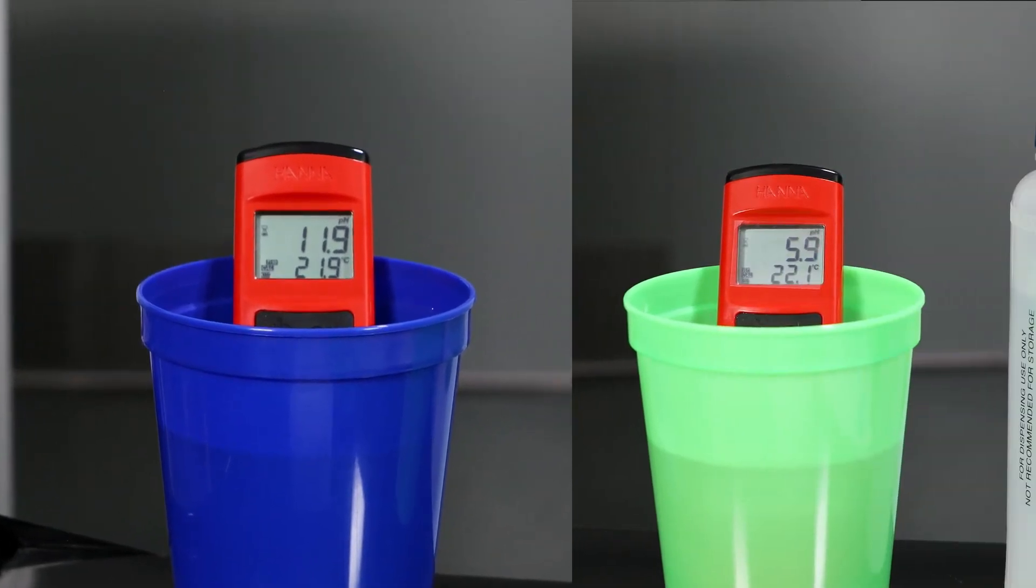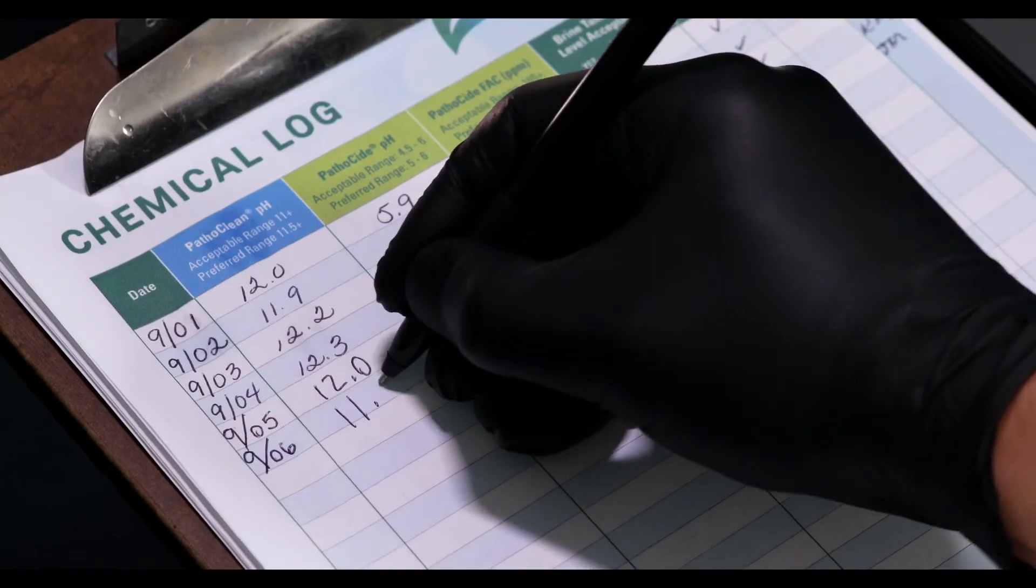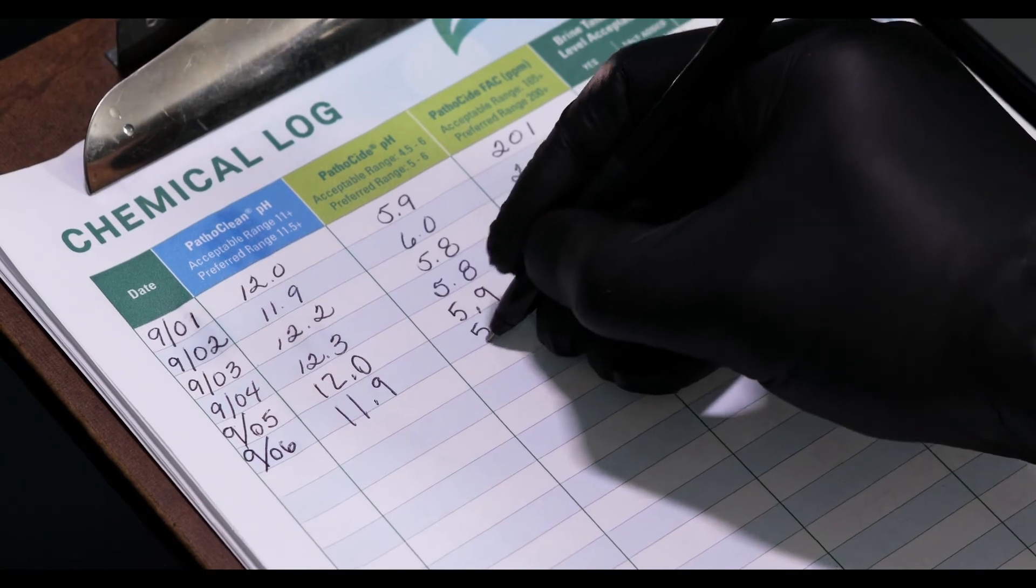The Pathoclean should ideally be 11.5 pH or higher. The Pathoside should be 4.5 to 6.0 pH. Record these numbers on the daily log sheet along with the date.